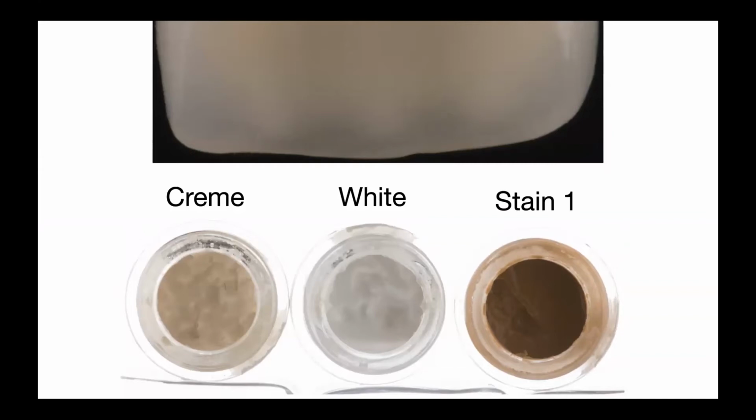But please, dear colleagues, pay attention that this halo effect is equal in its shade to the shade of dentin that we can find in the enamel third. So we can mix white with a proper shade stain to achieve the right color of our halo effect, and this way the aesthetic of our crown will be increased.